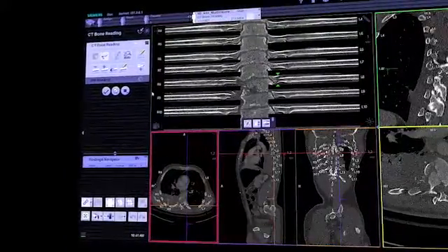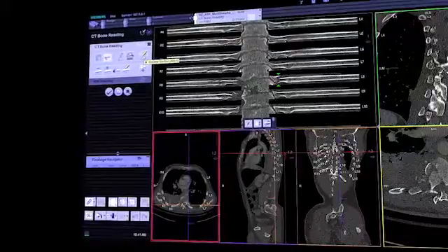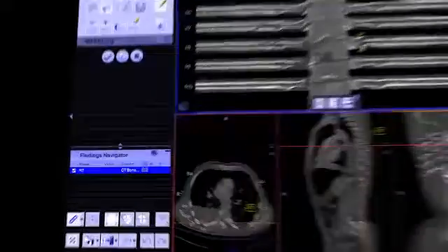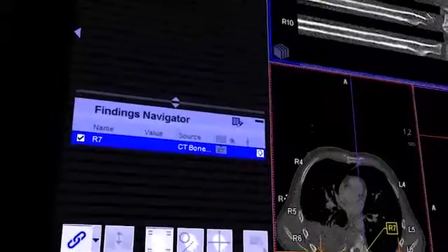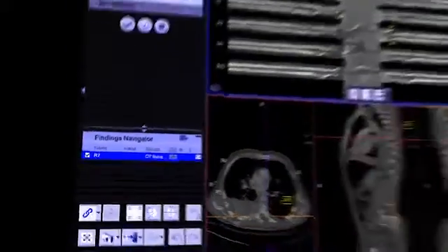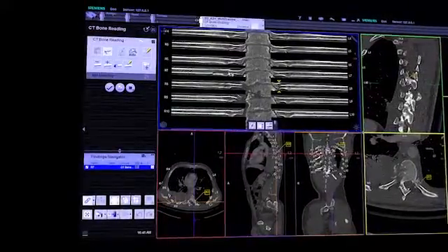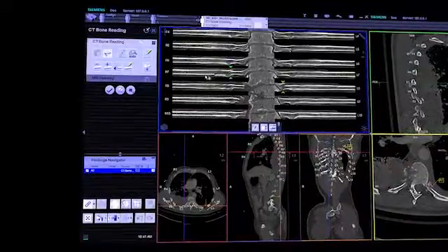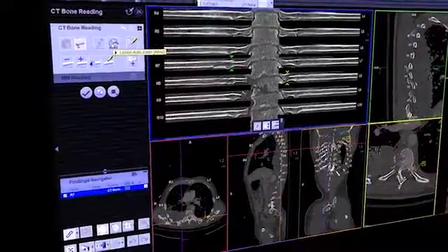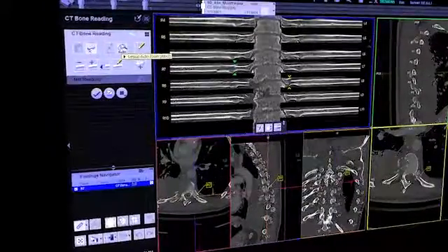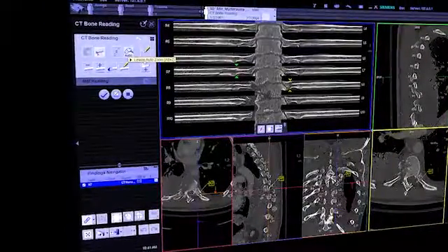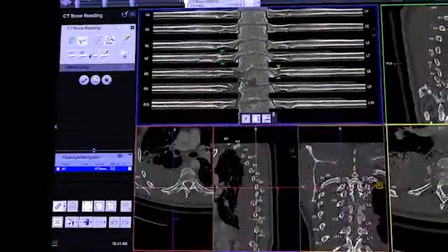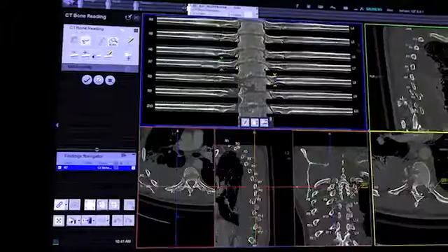As you assign a marker to the fracture, the corresponding information is automatically stored in the findings navigator for your final report. Apparently, the patient suffered multiple rib fractures. The lesion auto-zoom lets you focus exactly on the anatomy in question. In addition to simply scrolling through the axial slices, you may navigate along the ribs, as the system has calculated a center line for each rib.